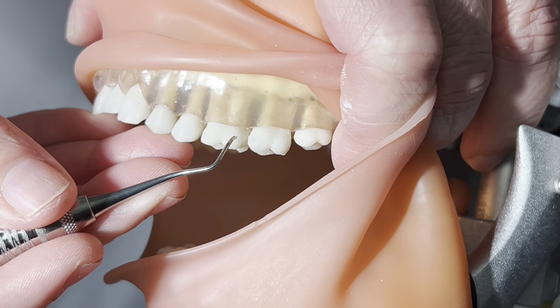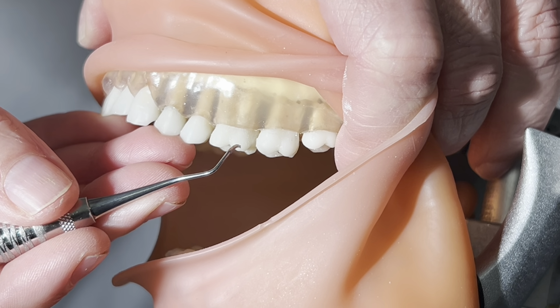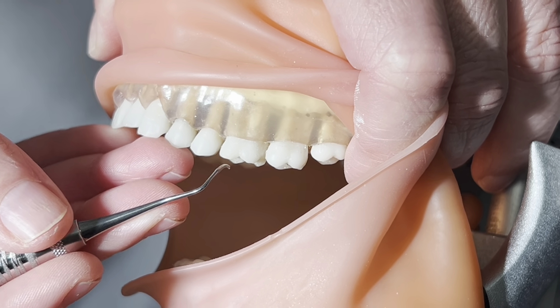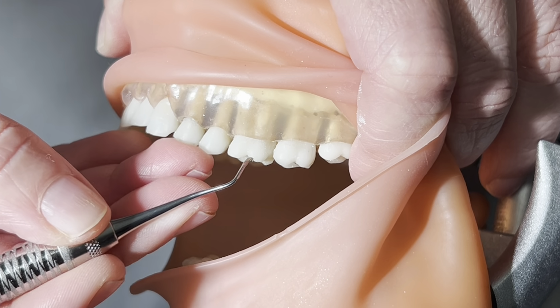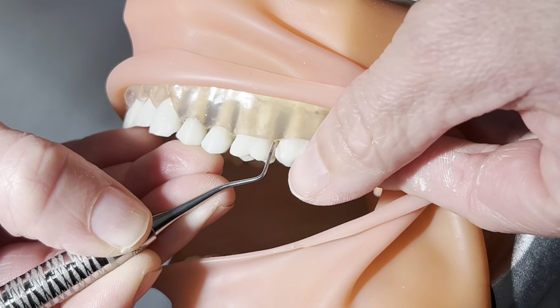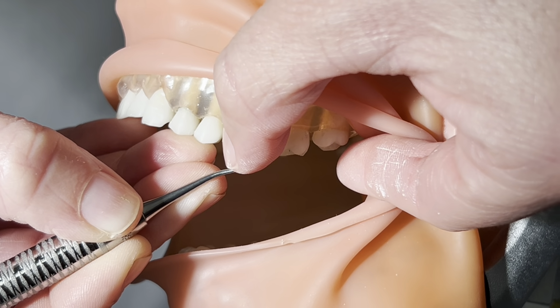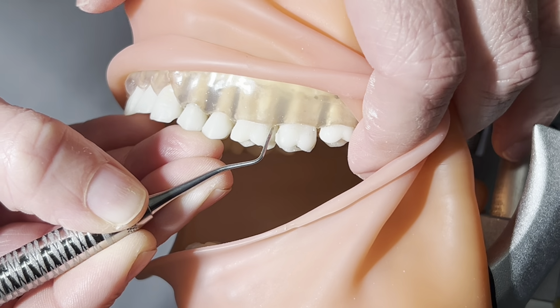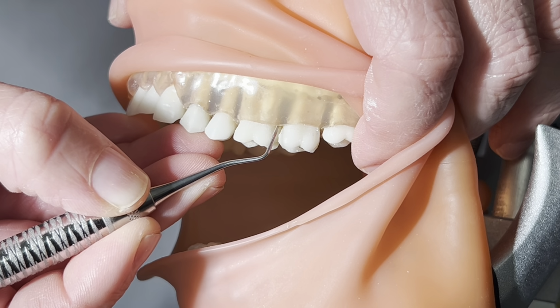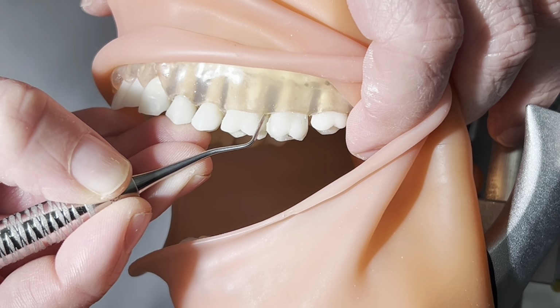Next, you will demonstrate correct angulation for calculus removal on a distal surface, buccal surface, lingual surface, and mesial surface. Starting with the distal surface, I always think it's easiest to start at 90 degrees. So 90 degrees, you will see that the lower shank is parallel to the long axis of the tooth. And 90 degrees is not the right angulation for calculus removal. We would like 70 to 80 degrees for calculus removal.